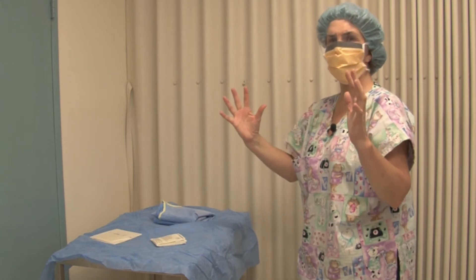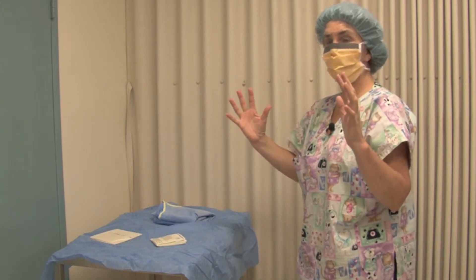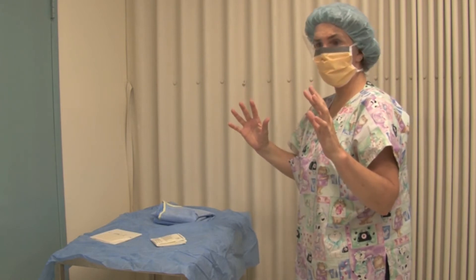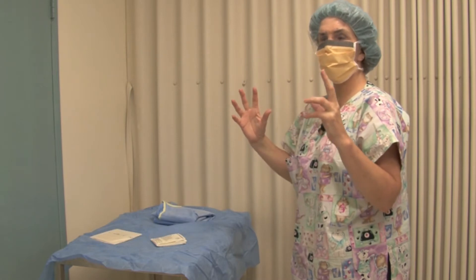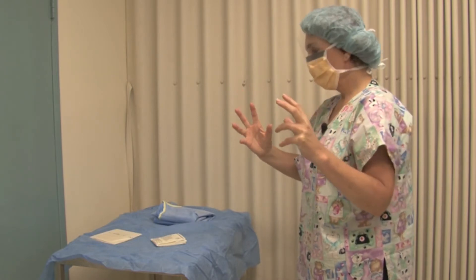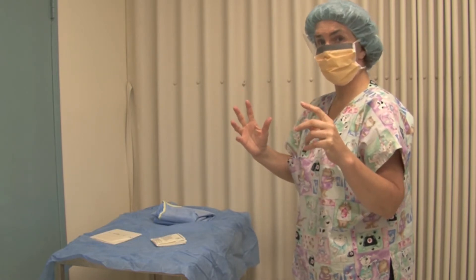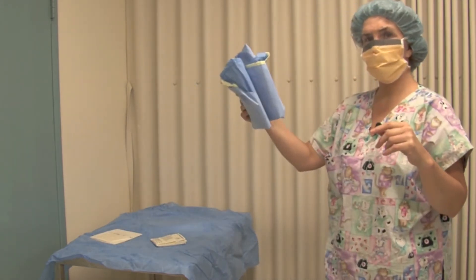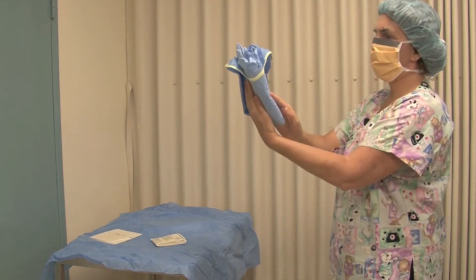It's really important at this point that your hands are dry, because we are about to glove. There is no way that you can glove with wet hands — you're going to make it really difficult for yourself. So it's worth spending time making sure your hands are dry, even though you've got people breathing down your neck saying hurry up and scrub. Next, you pick up your gown.